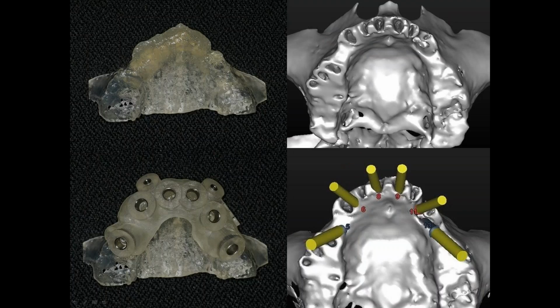Place our universal surgical guide. Our implants, and you can see the threads. We don't want to bury the bone all the way. We want to go ahead and use our graft to fill the sockets that you may see. These are areas where you still see some thread. See where we've used the ground particulate.